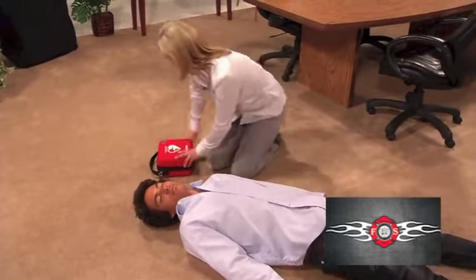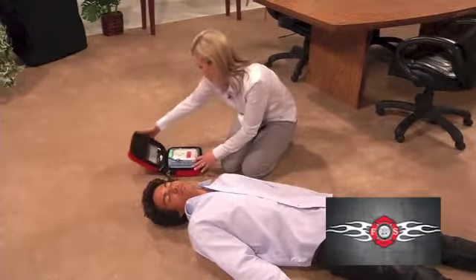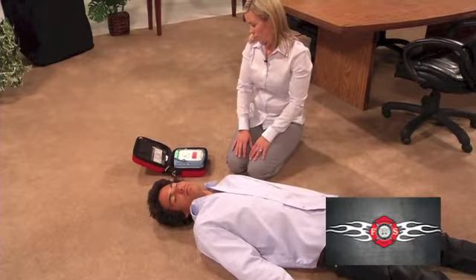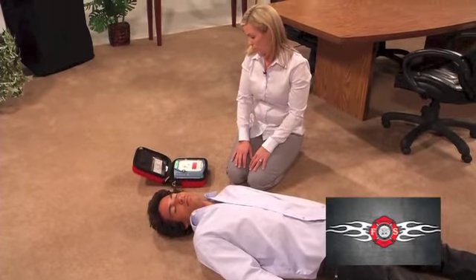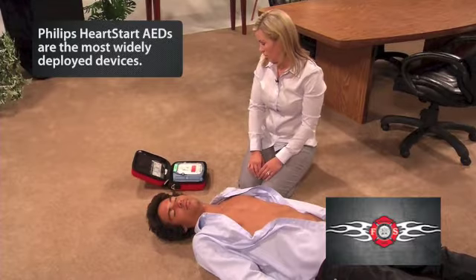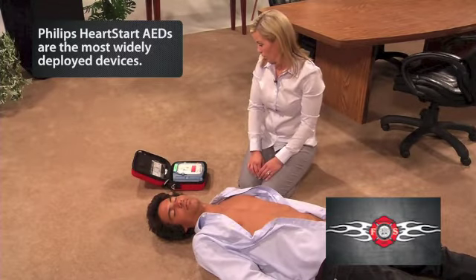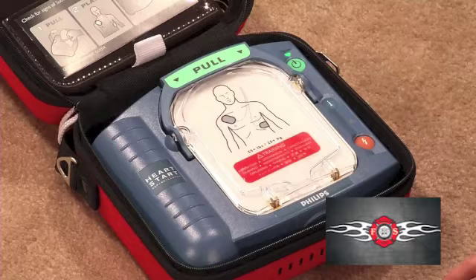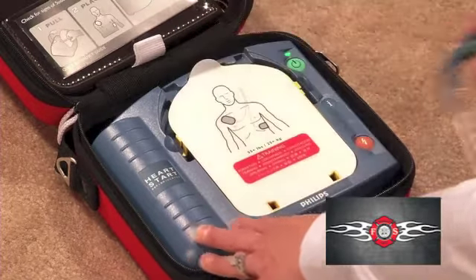Set the AED on the same side of the patient as you. Press the on button. Begin by removing all clothing from the patient's chest. Cut clothing if needed. You have already called 911, so remove the clothing from the patient's chest as quickly as possible. When the patient's chest is bare, remove the protective cover and take out the white adhesive pads.